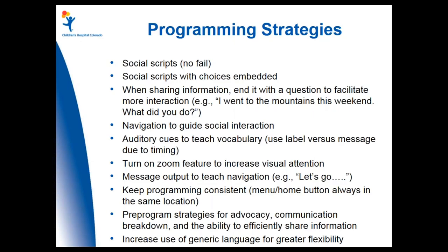Using the message output to teach navigation, so let's go would get you to the go page. Keeping the programming consistent, so leaving that menu or beginning button always in the same location. And then remembering to program strategies for advocacy and communication breakdown and the ability to share information efficiently, even as people become more advanced and are generating using single words, we still want those phrases, frequently used phrases for efficient communication, especially with folks that scan.